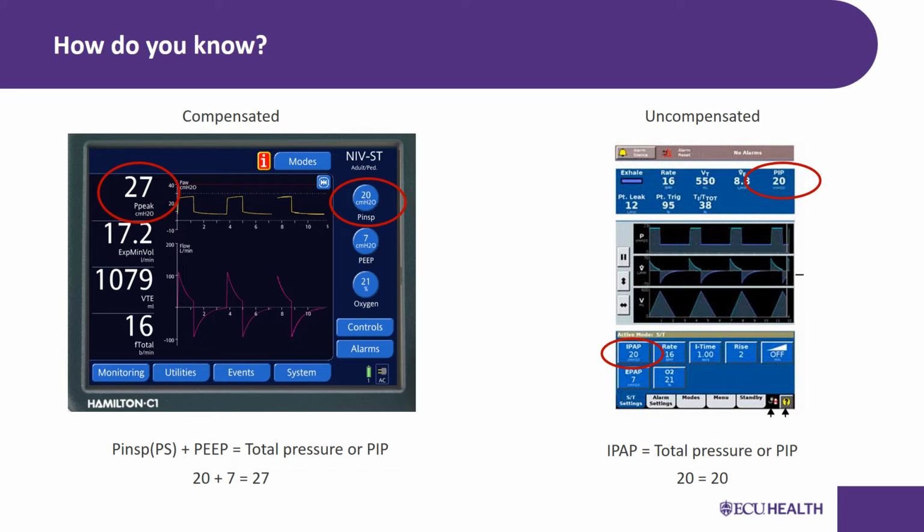So if you are used to utilizing an uncompensated ventilator, you need to be able to understand all of what we just discussed for when you walk into the realm of a compensated ventilator when it comes to peak.